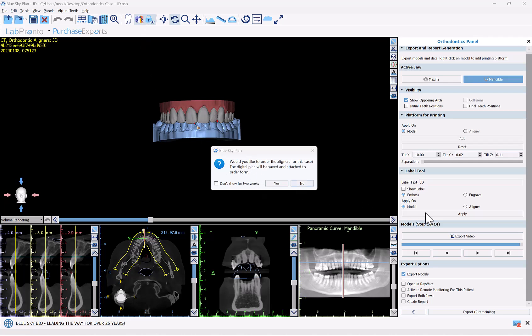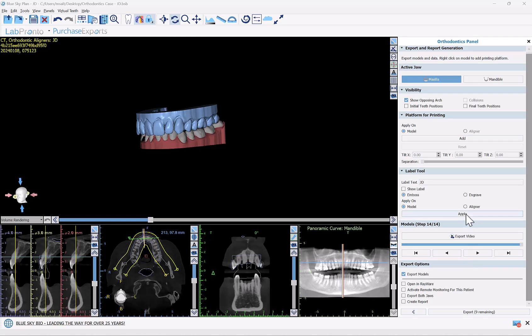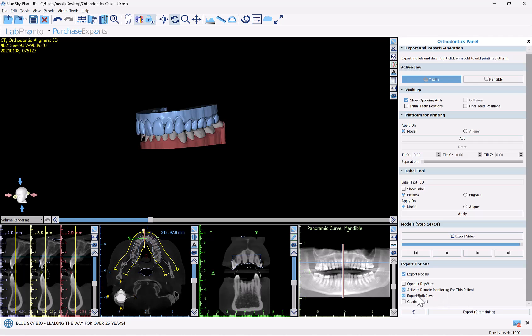I'm going to click no and scroll down to the bottom of the panel where we have the export options. We have options to label the models — you can emboss or engrave whatever text you want. We have the ability to add a platform for vertical printing and even separate the platform so you just have the heels. Now focusing on the export options: 'Export Models' is checked. Our new functionality here is 'Activate Remote Monitoring for this Patient.' The checkbox for 'Export Both Jaws' is checked automatically when we check 'Activate Remote Monitoring for this Patient.'